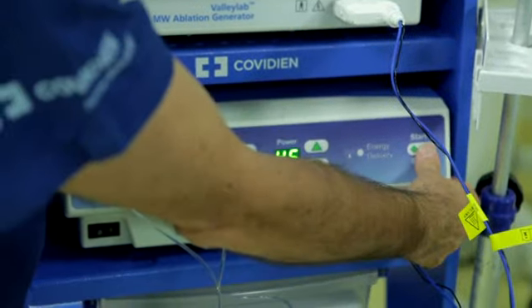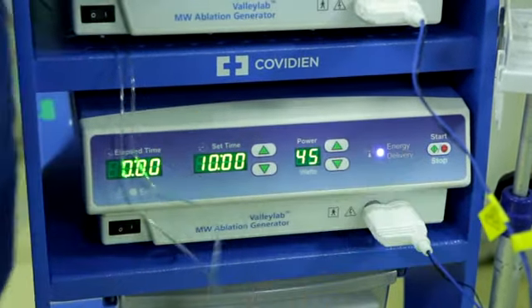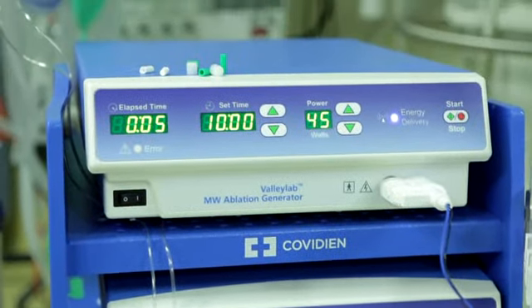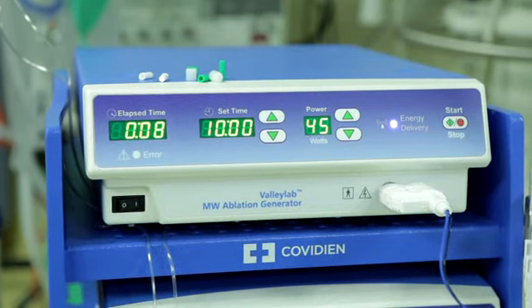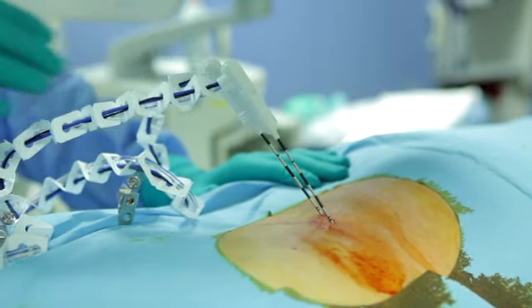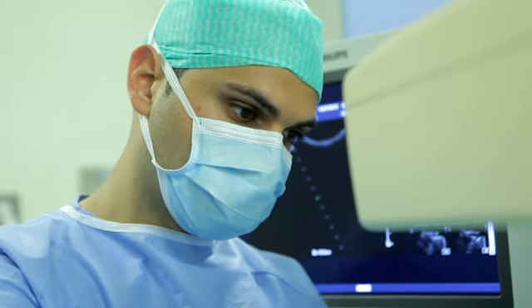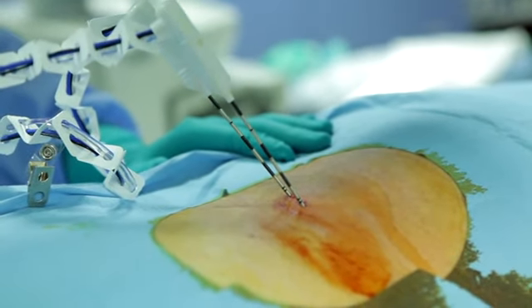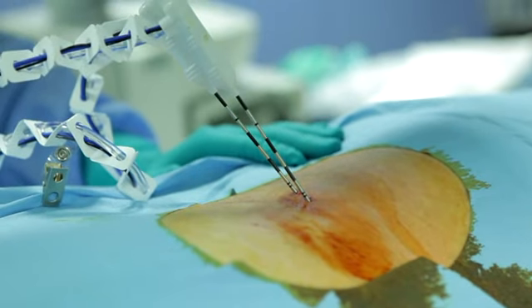This is our study because we would like to compare to other techniques like radiofrequency ablation or cryoablation. And up to now, we demonstrated that it's a safe procedure and doesn't worsen the renal function. It is also very interesting because the procedure time is shorter compared to other procedures. And compared to cryoablation, we can reduce costs and reduce the number of accesses and the number of needles inside the lesion.